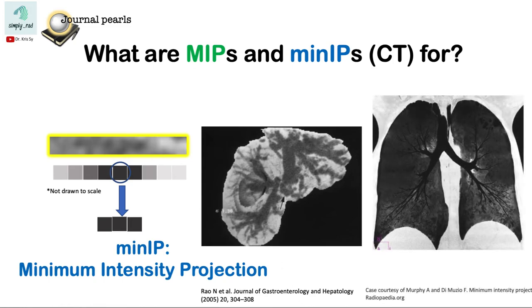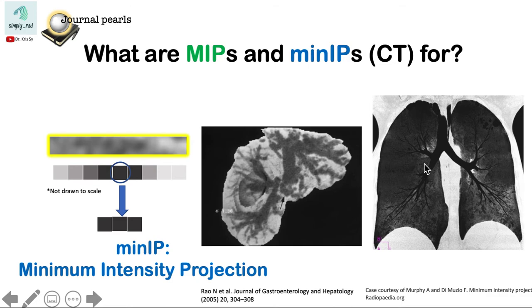It's also useful for examining the airways, like the trachea and the bronchi, for examining bronchiectasis. Note here in this MinIP, the vessels are suppressed and this image only displays the lung parenchyma and the bronchi.